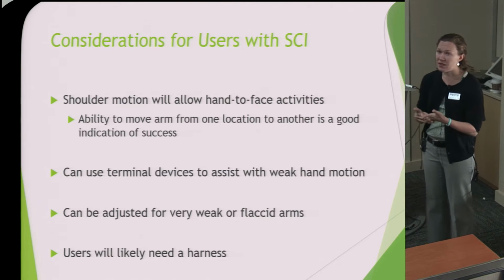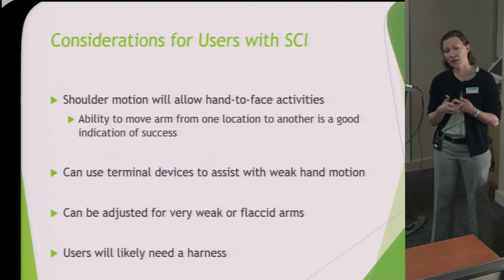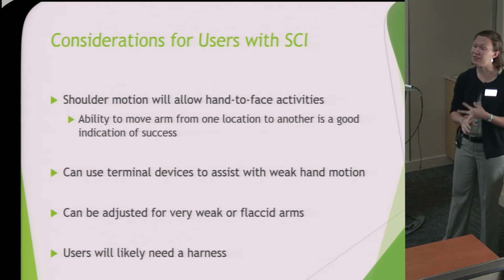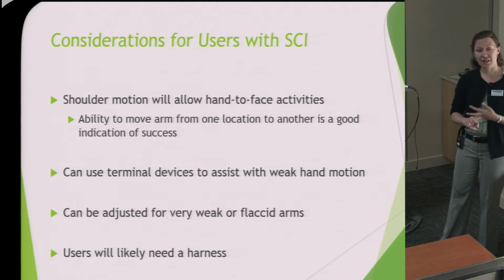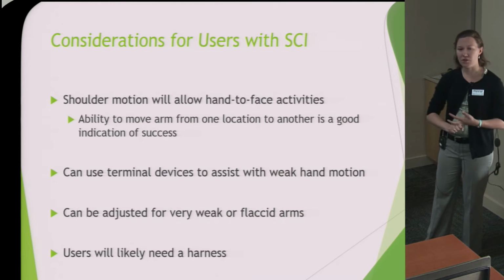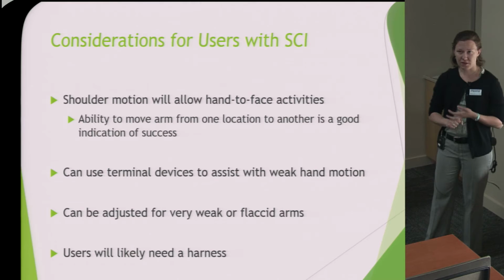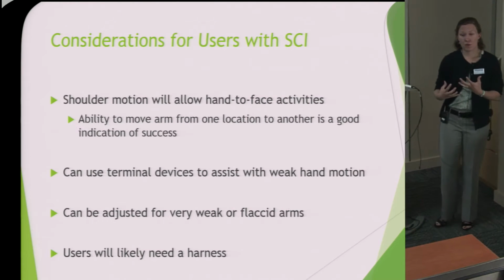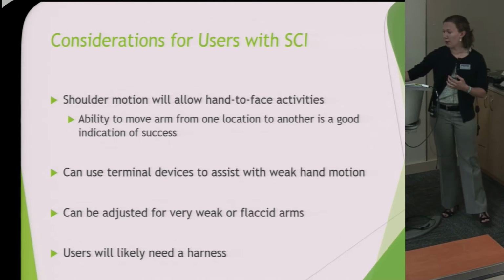The settings on this can be adjusted for a very, very weak EMG, so this is especially appropriate for patients with a very weak or very flaccid arm. They don't have to have a ton of active motion or active strength in order to be able to power this device. And these users will likely need a harness just to help offset the weight and to help protect the shoulder.